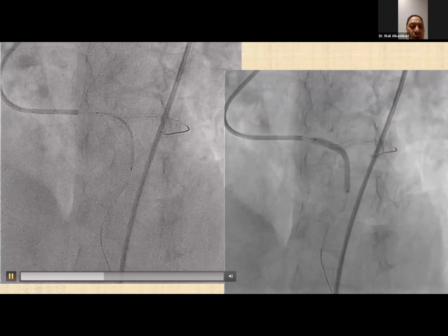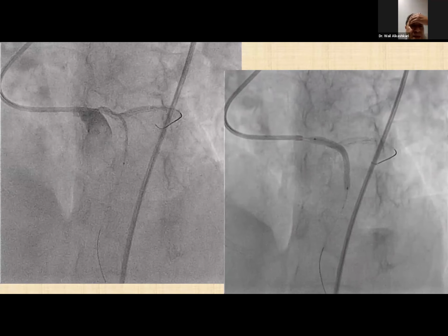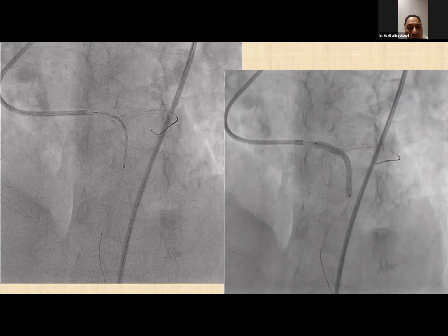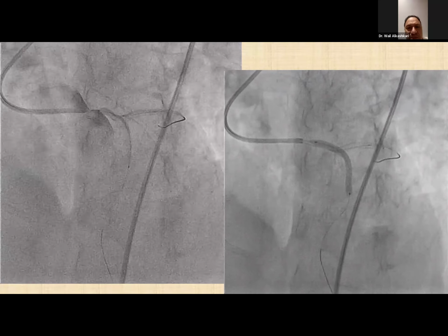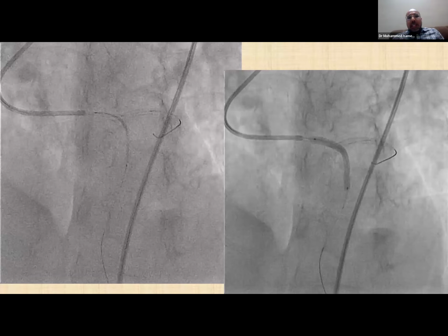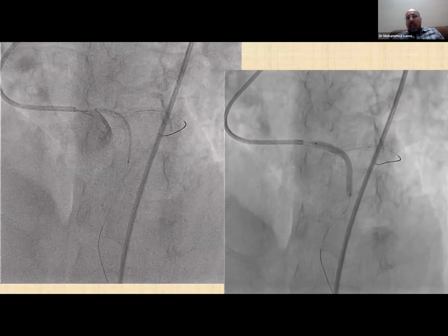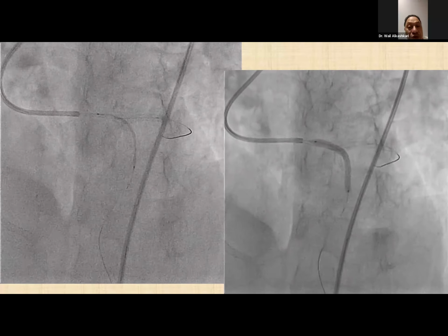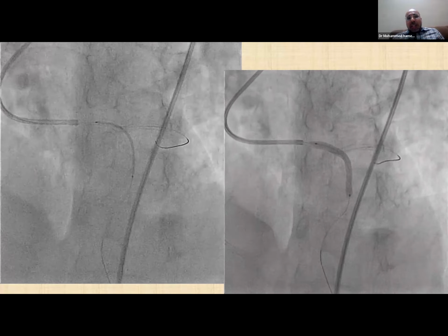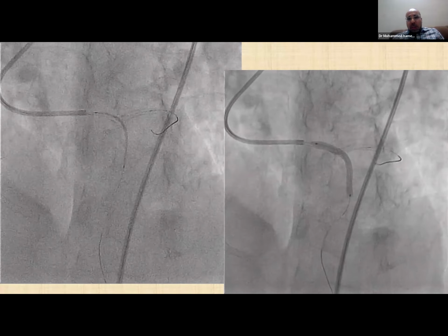I like how stable the stent is, even with this left main. Sometimes when the stent is ultra thin, it moves a lot. Go ahead. So this was what, 3.0? There is a 3.0 stent, and of course in this step we are searching for a stent that has good expandability. This is one of the advantages of Nagumi: this 3.0 stent we can expand up to 4 or 5 in the left main. Up to 6, by the way. Yeah, up to 4 or 5. This is an Indonesian female lady. She has a low body mass index, so I think 4 or 5 in the left main is acceptable.